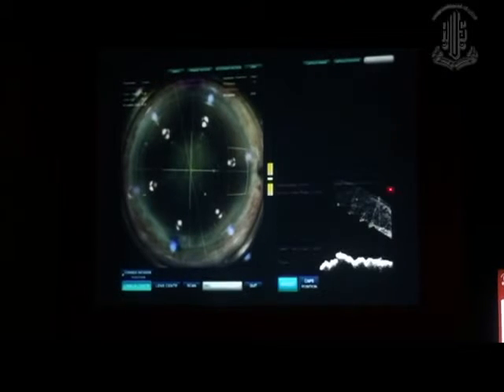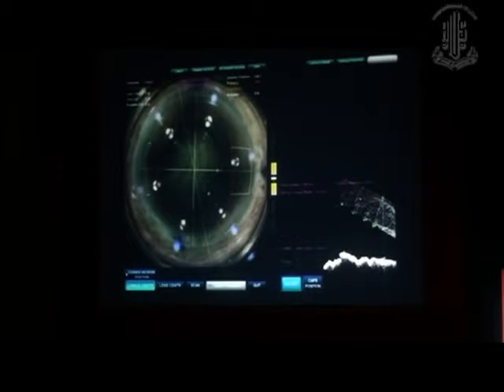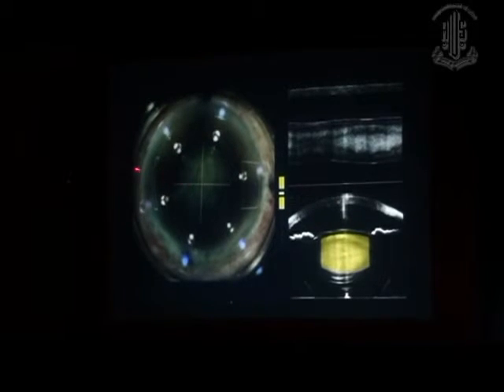Now when you go on to corneal thickness, you can see the corneal incision. Can you see this? You make a triplanar incision as you want, and then you press accept. After you have pressed accept, you will go on to the LRI or the arcuate incision that has been made here, and we set it at about 90% of the corneal thickness in the periphery where we are going to do the LRI. So we press on this area, see that it is fine, and we are ready to fire.